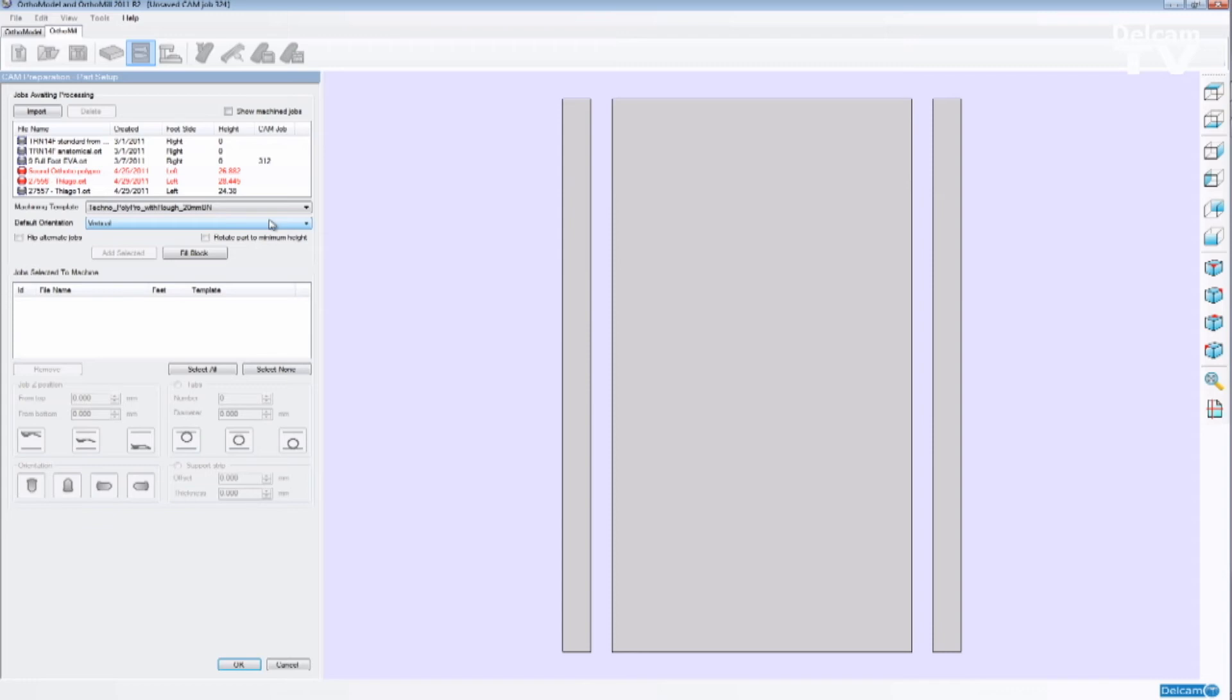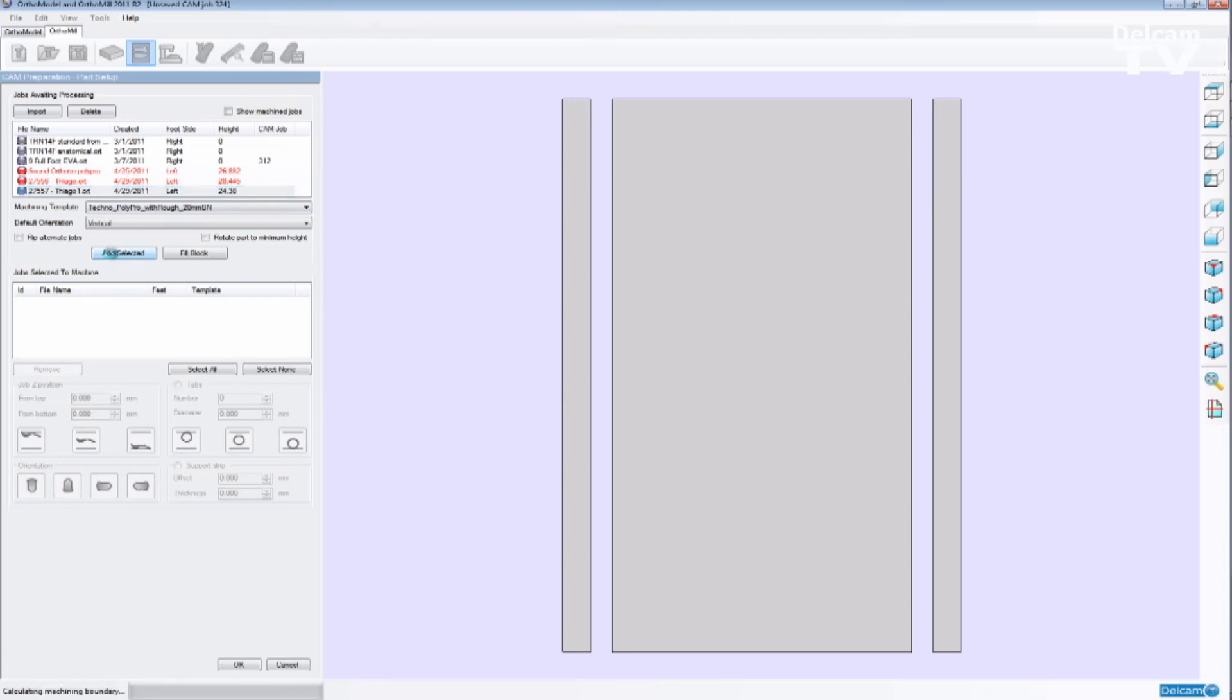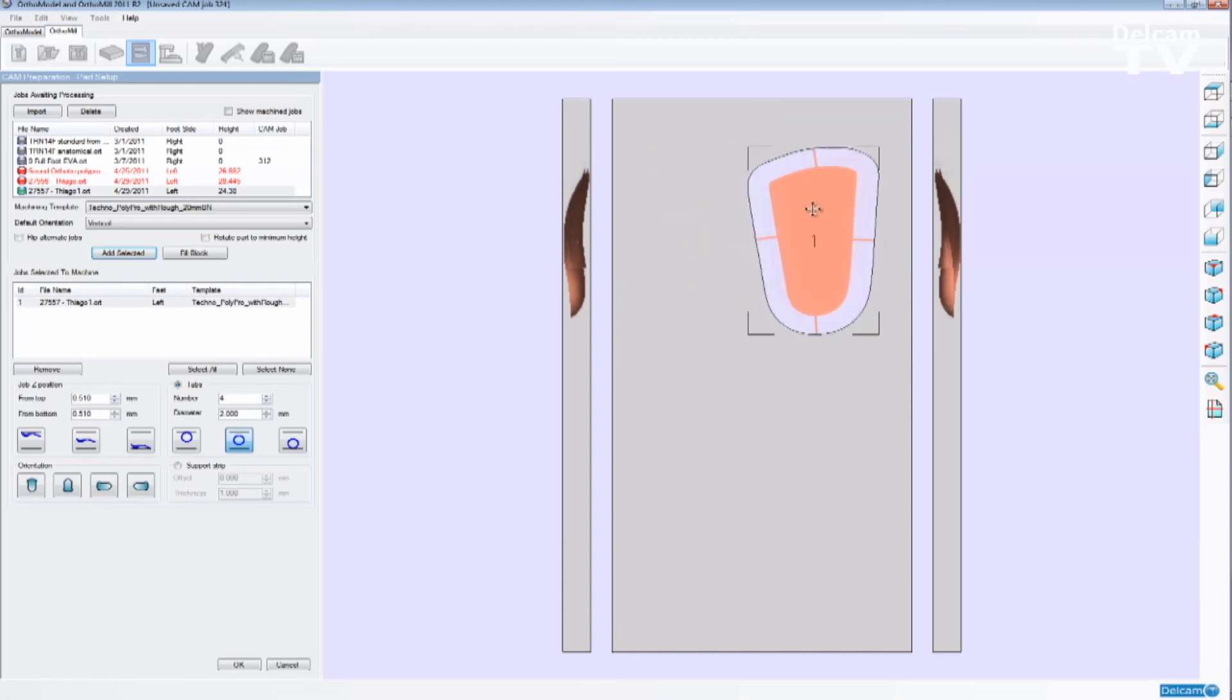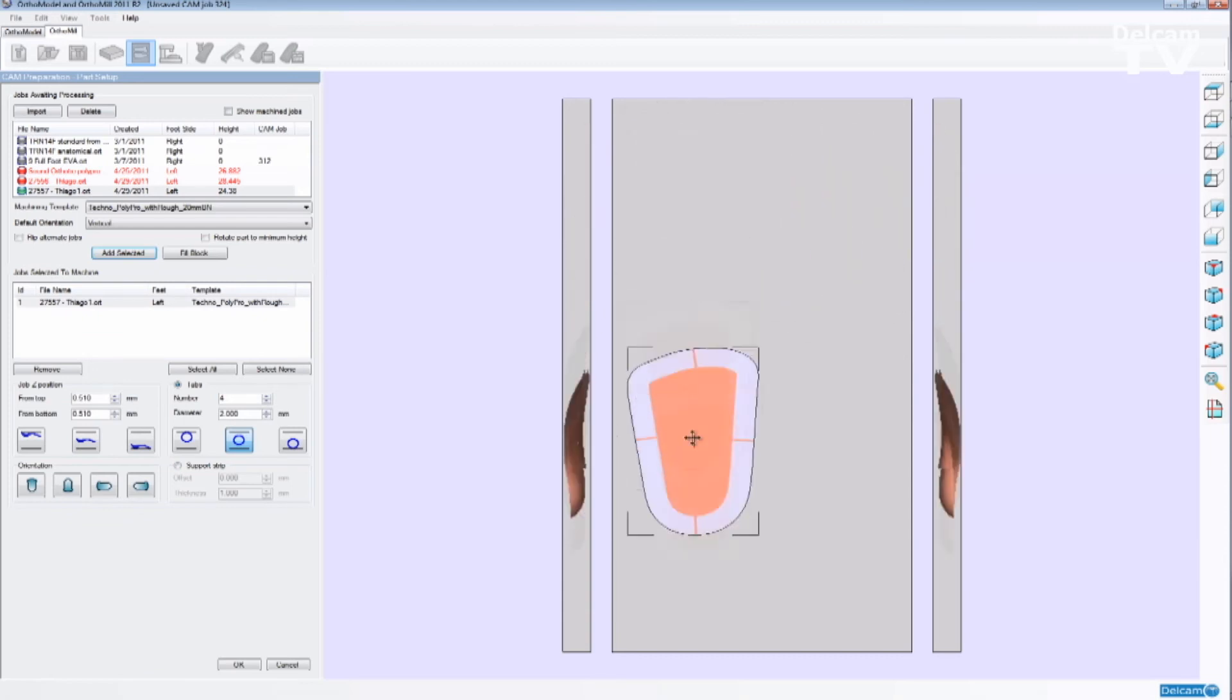Then I'm going to select an orthotic so I can place on the block. And as you can see OrthoModel tells me that some orthotics are not going to fit on a one-inch block. I mean you need to select a thicker block. The last orthotic that I have designed fits the block because it's not as big as one inch. So I'm going to add the orthotic on the block.